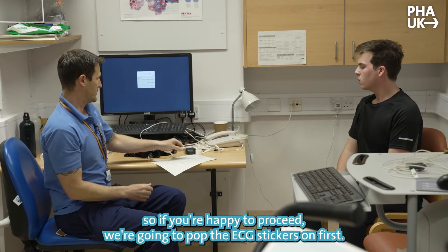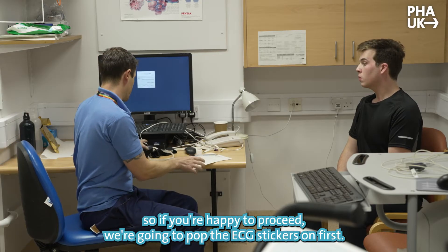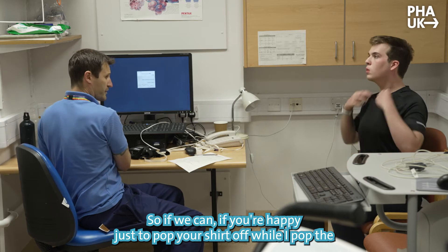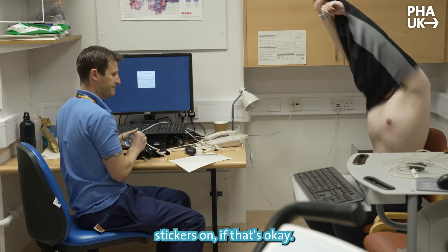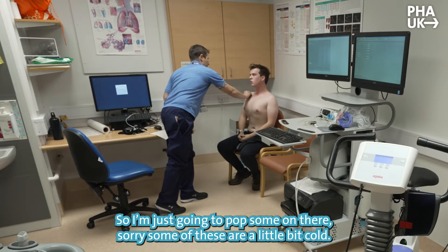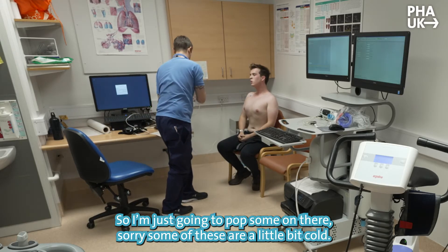Okay, so if you're happy to proceed, we're going to pop the ECG stickers on first. If you're happy to just pop your shirt off before I put the stickers on. So we've got ten stickers altogether — some of these are a little bit cold.